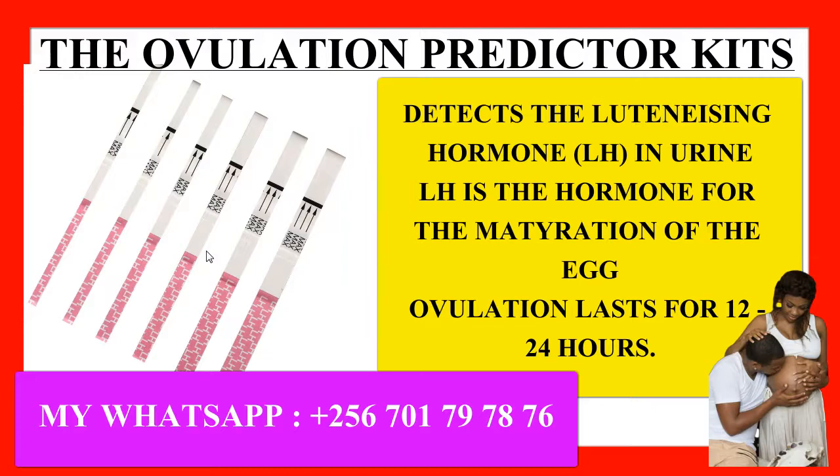In today's video, we've talked about the ovulation predictor kit and how it works, and we have said that normally the ovulation predictor kits are testing kits which look for the hormone known as luteinizing hormone and estrogen. But specifically, the commonest types are those that are designed to detect the levels of luteinizing hormone.